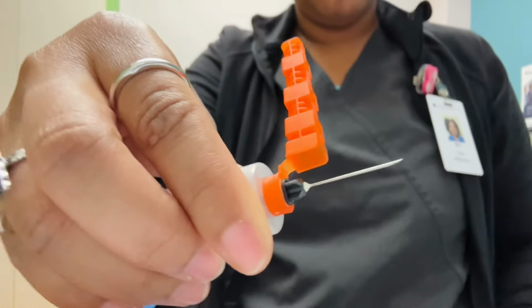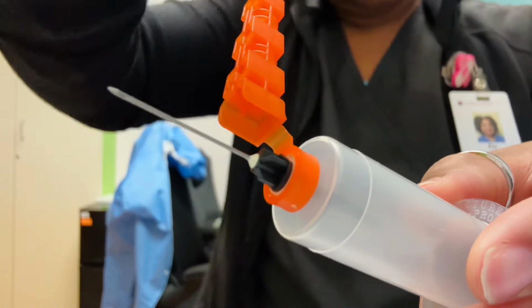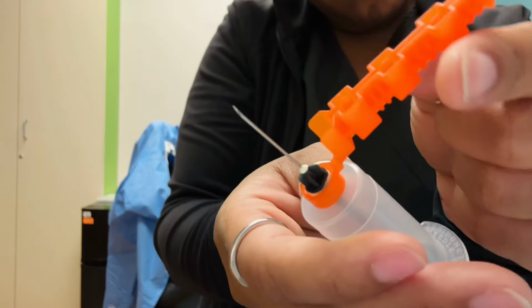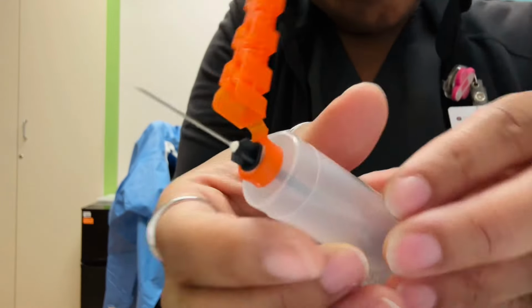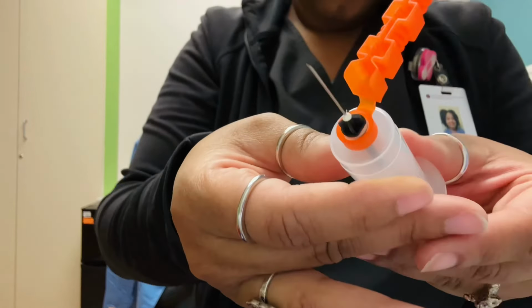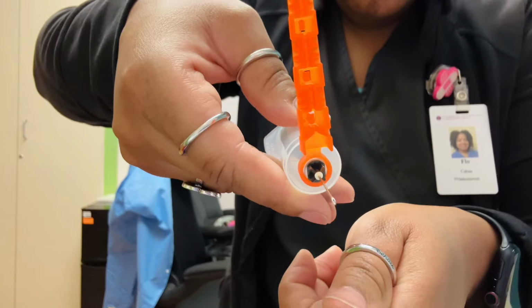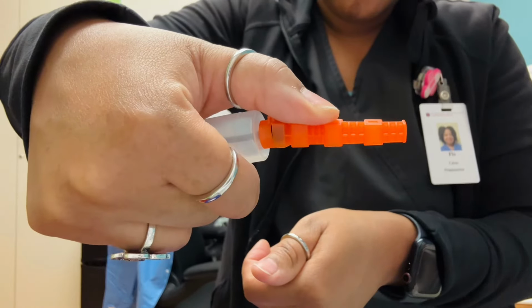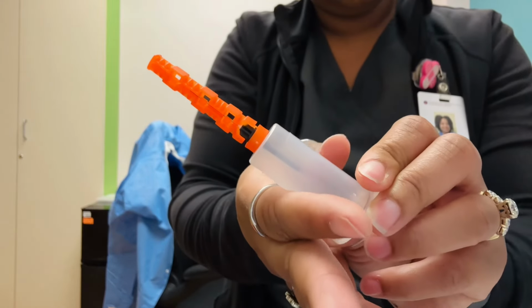So you're just going to pull slightly, and as you can see with the needles that don't have the safety on them, the bevel is not in the right direction. When using the hubs with the safety lever on it, you will turn, which is going to rotate your lever so that when the needle bevel is facing up, that is the proper way to use the hubcaps with the safety holder for a needle that doesn't have its own safety lever. So in layman's terms, your bevel will be up and also your safety lever will be up towards you when you are drawing blood. When you are finished, you will remove the needle, place your thumb and activate the safety lever onto the needle. You will hear it click and it is safely secured. Then discard in the sharps bin.